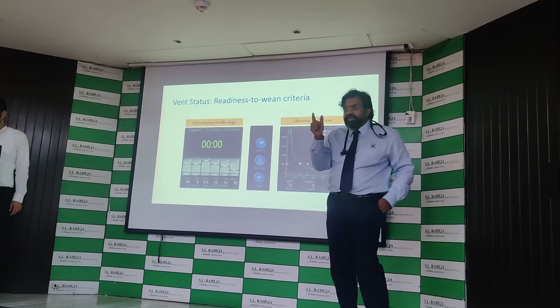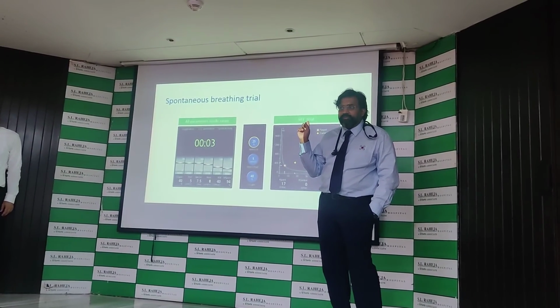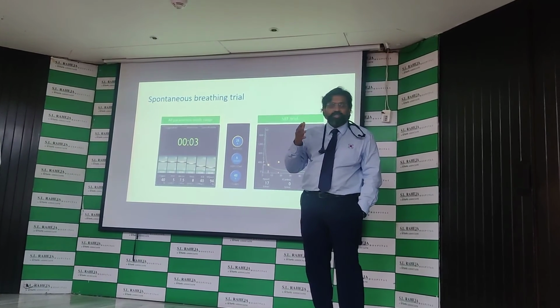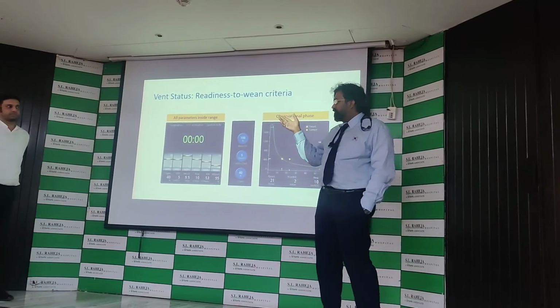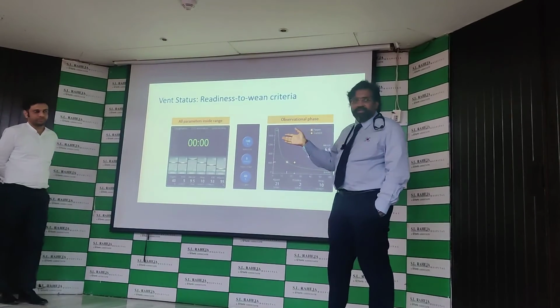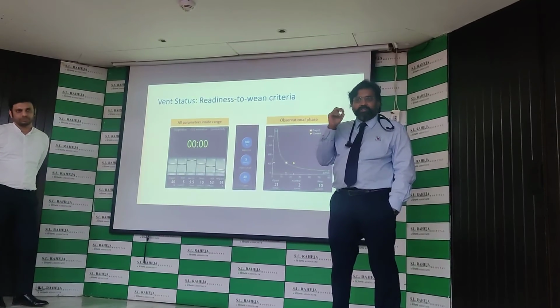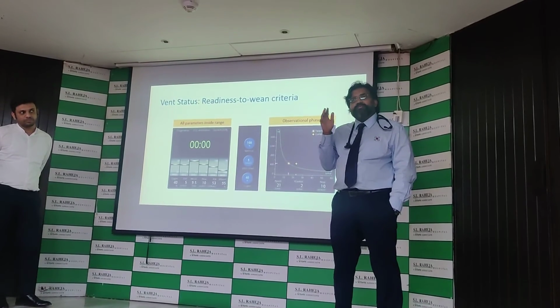So what also you can understand is by looking at the respiratory time constant there. What is happening there? Respiratory time constant, you have an idea. RC expiratory जो आता है उसमें, it's a number that comes in the monitoring. So you see the RC expiratory, you will understand what is happening there. If your respiratory time constant is going lower and lower, you can understand that the compliance is worsening and worsening.